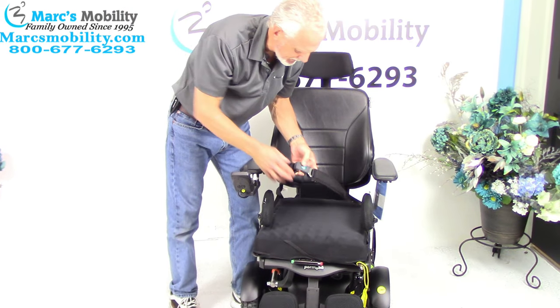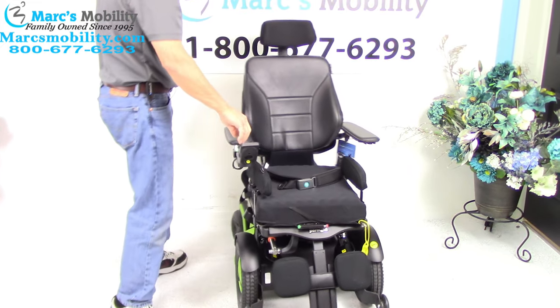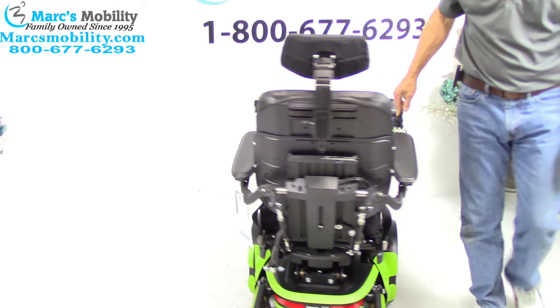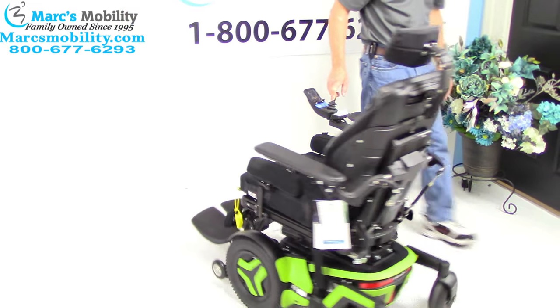You also have your safety belt right here. And you can see how the chair turns in a circle — this is your turning circle on a front wheel drive. This is how it would turn inside your house, so you need a little bit bigger turn, but not much of a bigger turn.